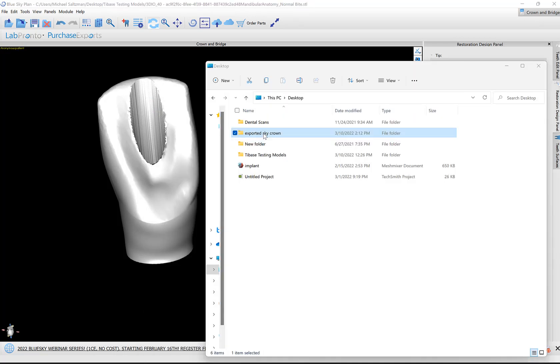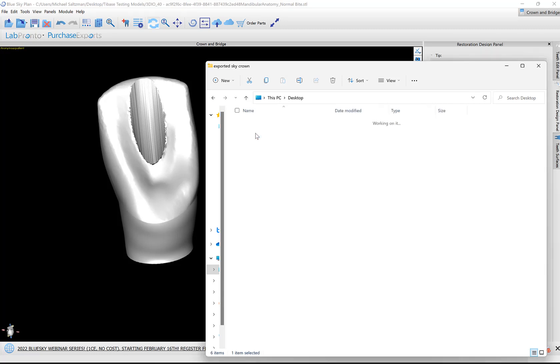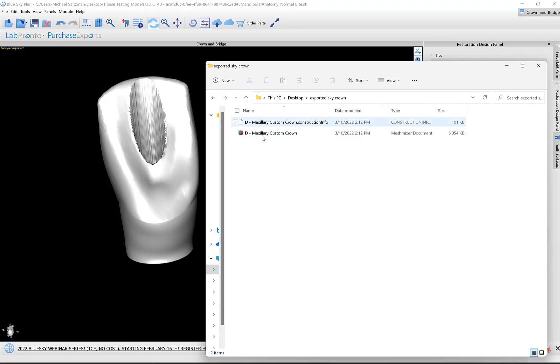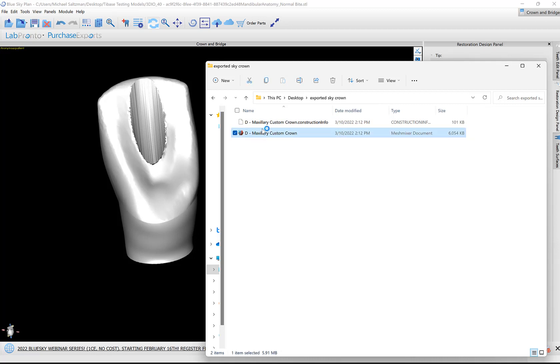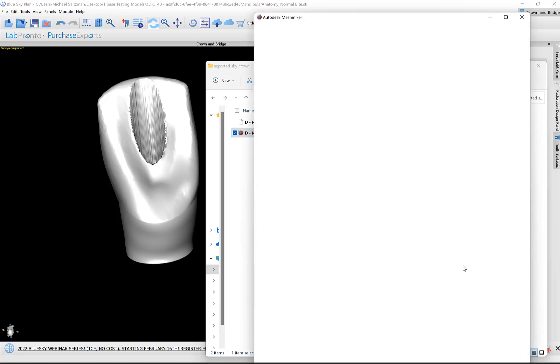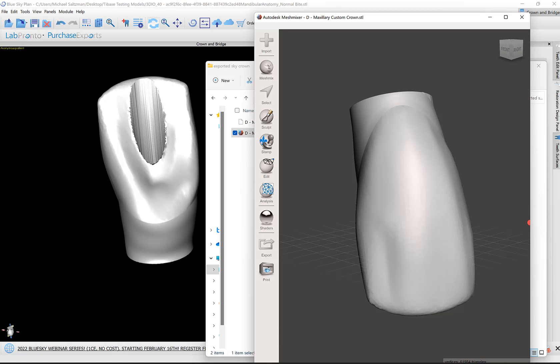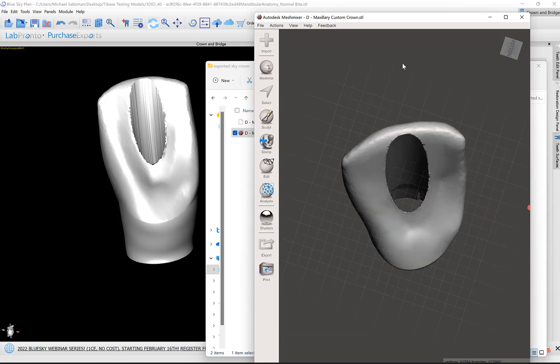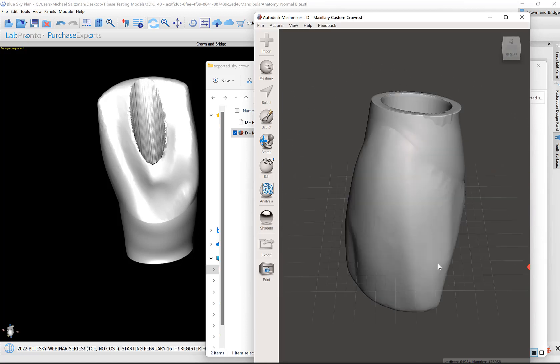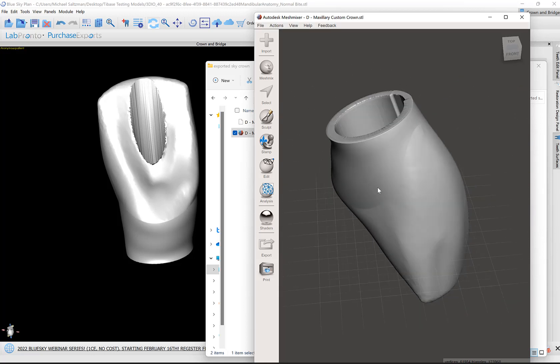Here's the folder that we just created, 'Exported Sky Crown.' I can open it up and here we see the two files. We have our STL file and we have our construction file, the XML file for milling. Here is our designed crown.